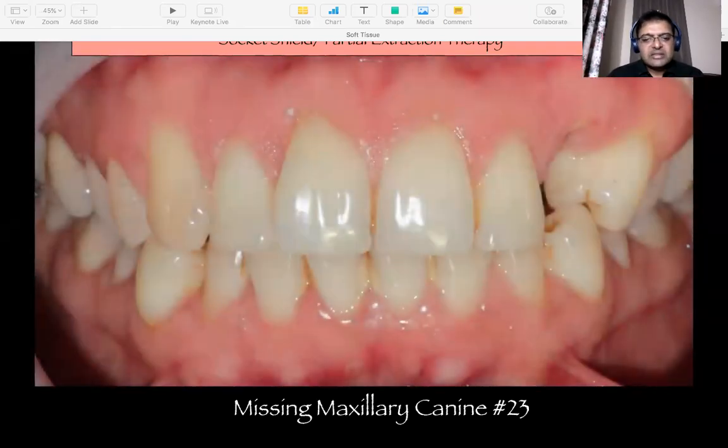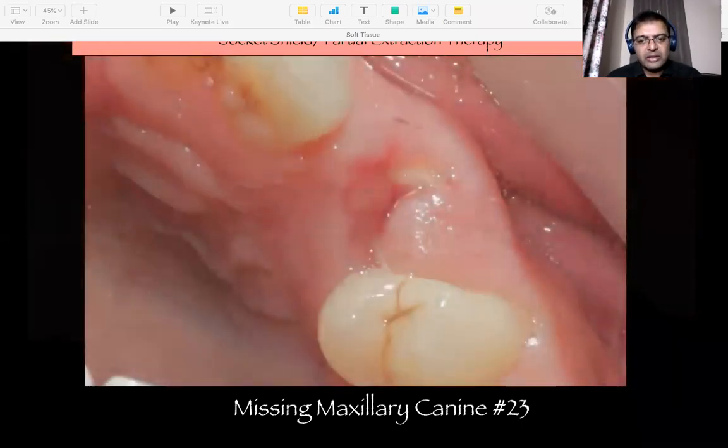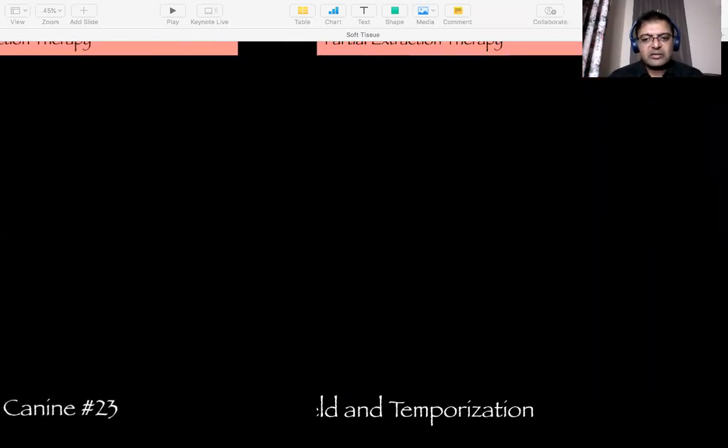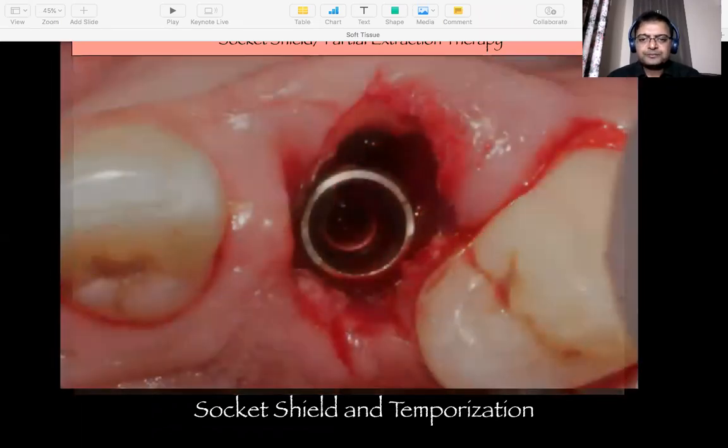So let's look at this case, a socket shield of a maxillary canine. You can see the canine was broken in this individual. You can see stippling around that site. So we decided to do a partial extraction therapy, or a socket shield, what is more commonly known as. So we remove the tooth and leave the labial portion of the tooth in situ.